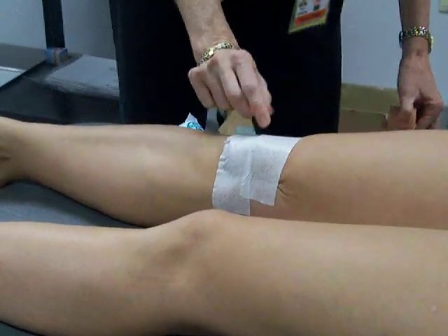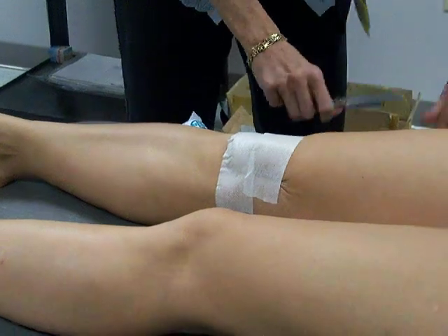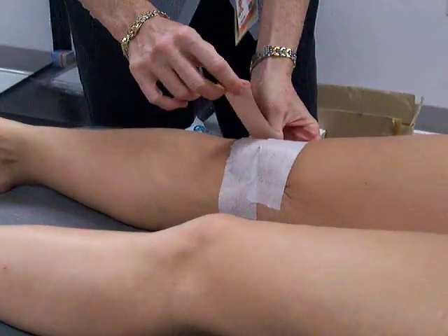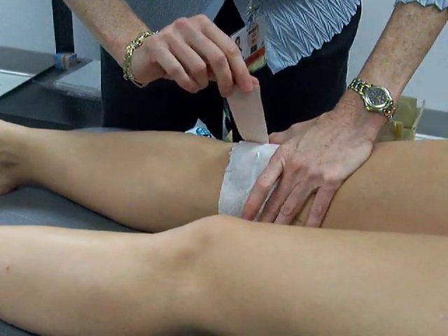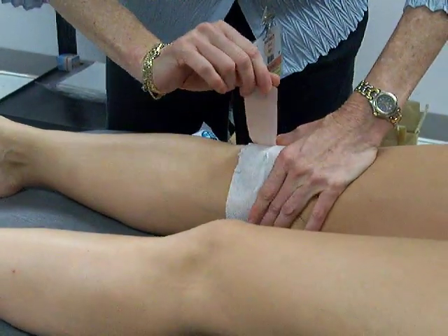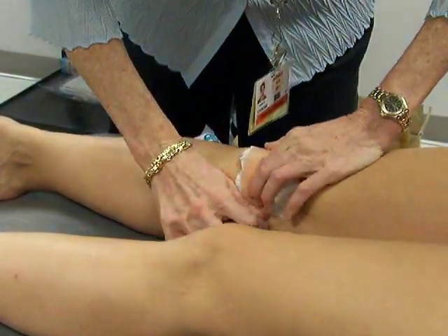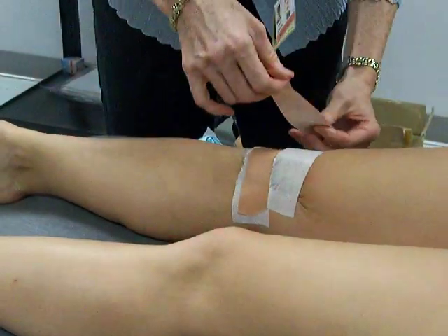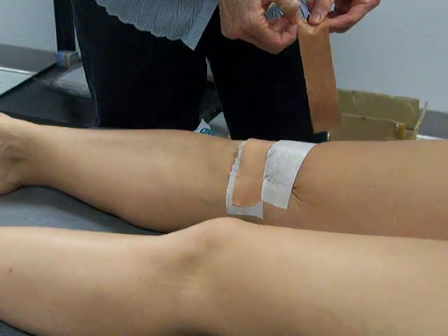Everything overlaps about a quarter of an inch. Same thing — PPL. Push the kneecap, pull the tape, and then lift medial soft tissue. You may get a little wrinkle on the medial side, which is fine. These do overlap — don't leave a little space in between your tape.